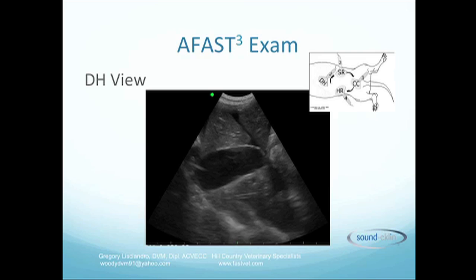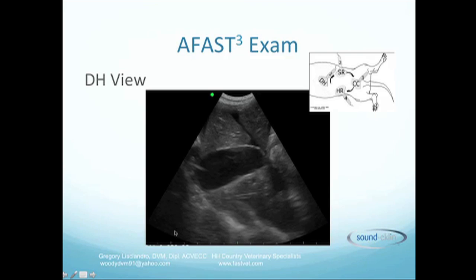On the DH view, what is classically obtained is the gallbladder kissing the diaphragm. As I draw the cursor around the gallbladder, you can see it is kissing this other bright hyperechoic line which is the diaphragm. We can also look into the pleural space with this type of depth.